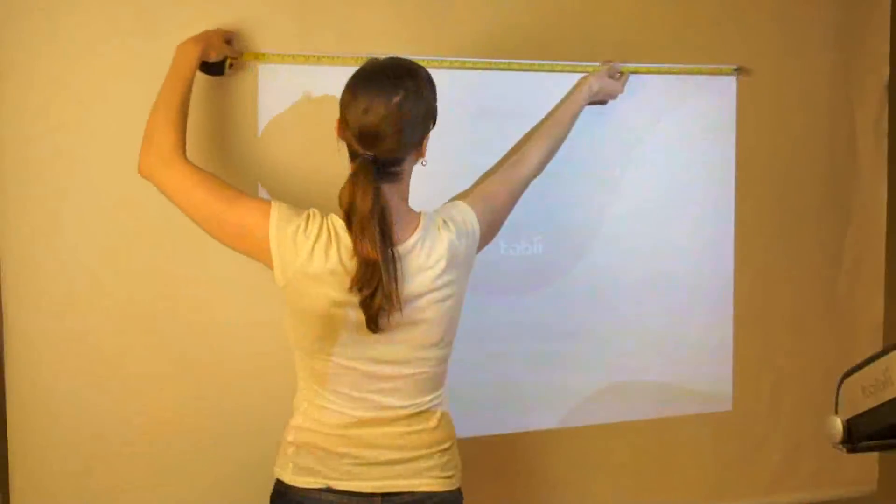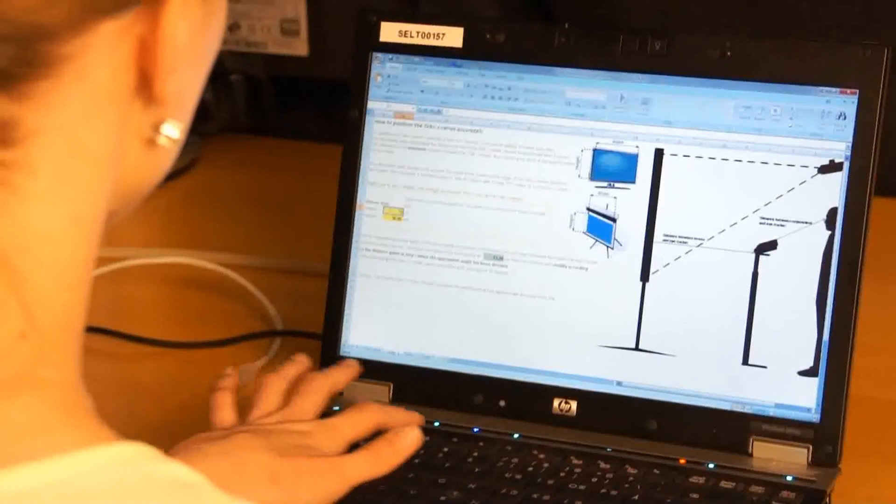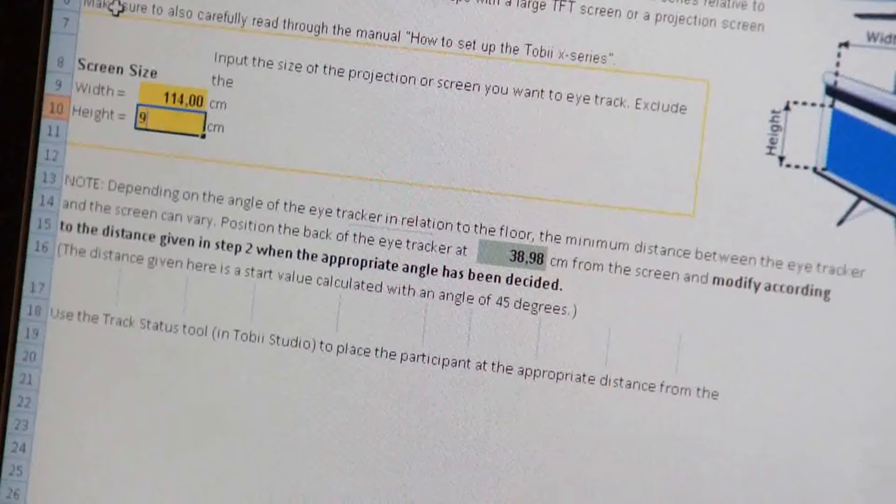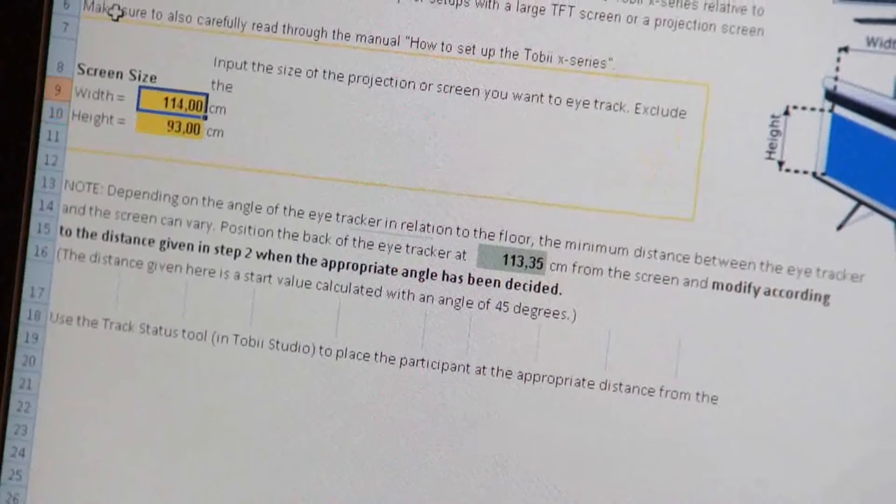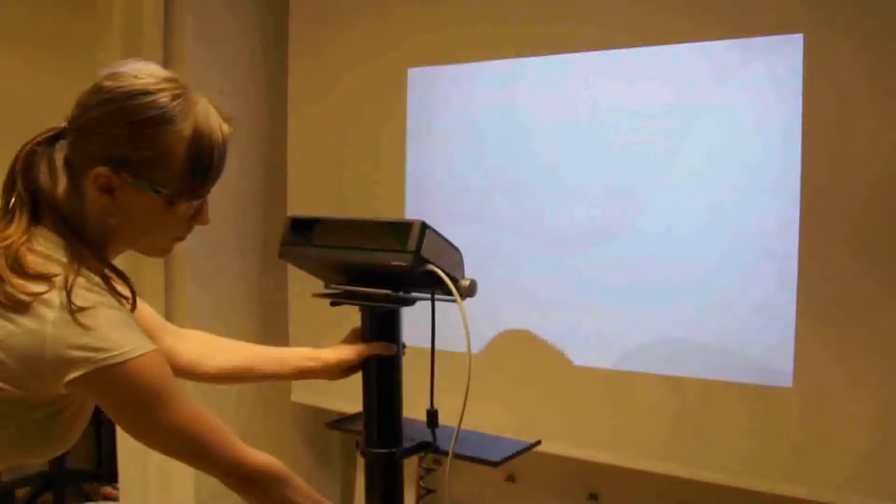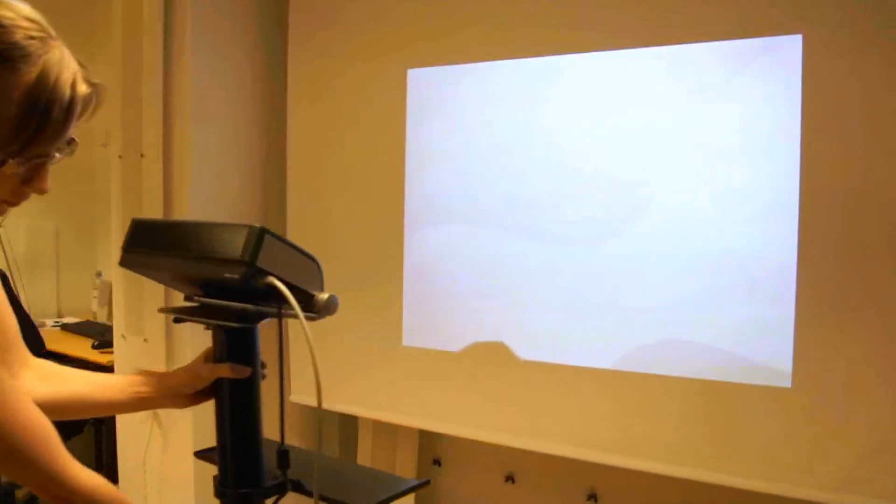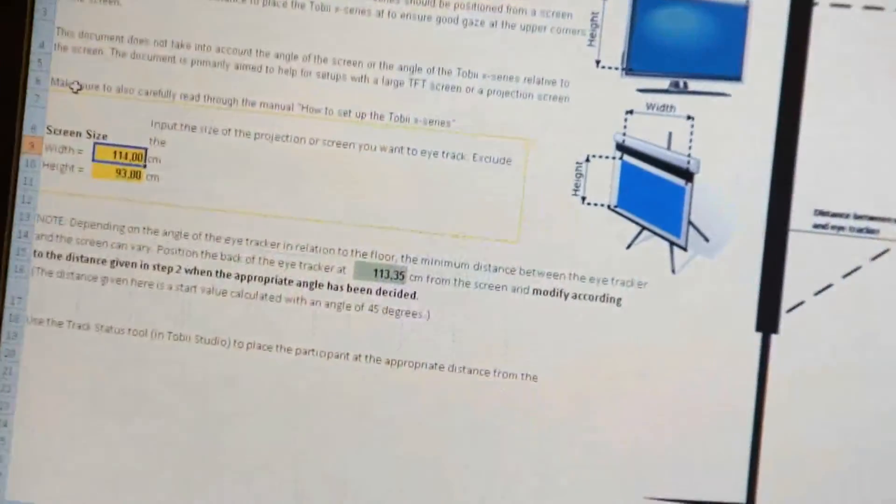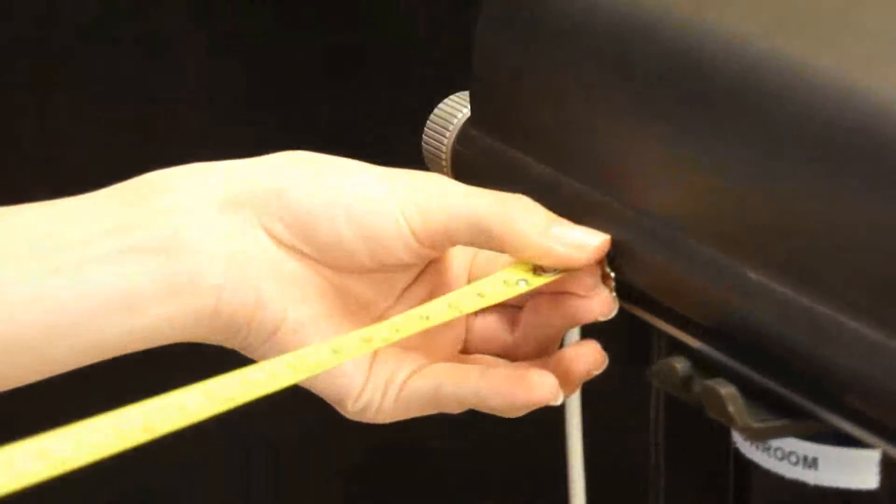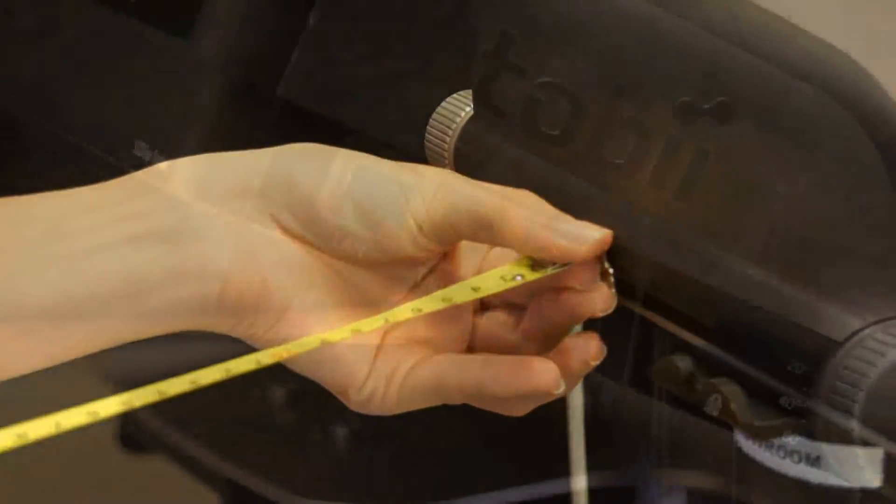Measure the height and width of the visible projection. Enter both values in the configuration guide. In the green box, the minimum distance is shown. Place the eye tracker centered in front of the screen and make sure not to go below the calculated distance. Please note that the calculated value is the minimum distance.